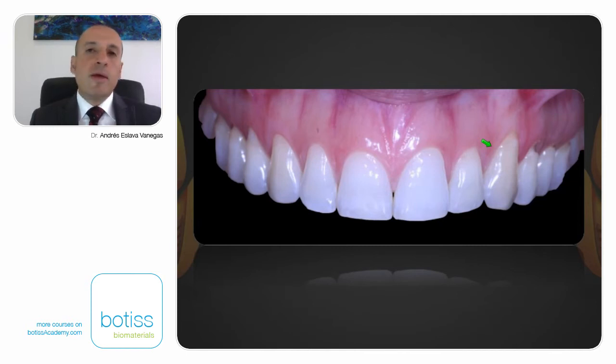That's Juliana. Remember the girl that I talked about, her parents were dentists. And that's the appearance of the upper jaw. She had a really high smile line, and she had recessions after orthodontics in this area, from canines to molar, from premolar to molar. And look at this very thin biotype. And she wants to do something with that, and she doesn't want to have another connective tissue graft or free gingival graft. And remember, how long is it from the first molar to the first molar? How much are we going to need? How much tissue graft are we going to need to do that?